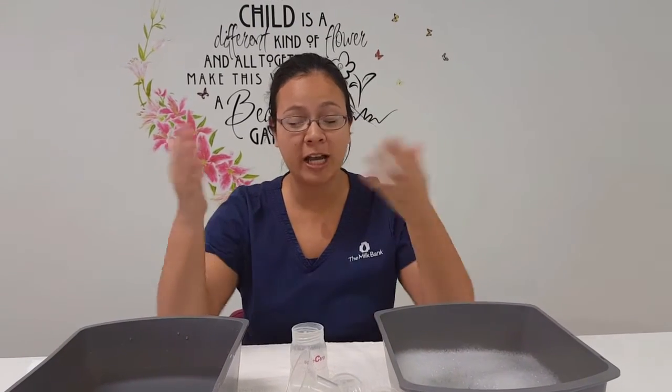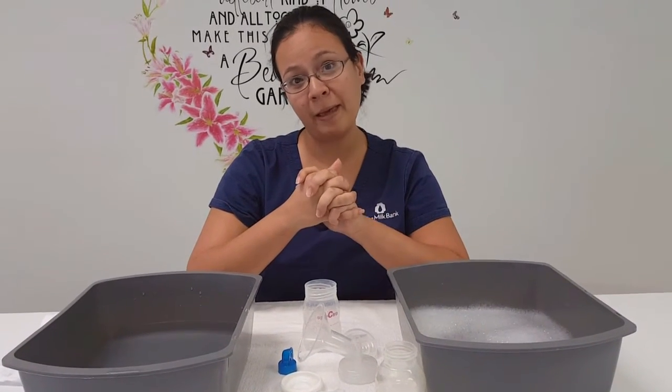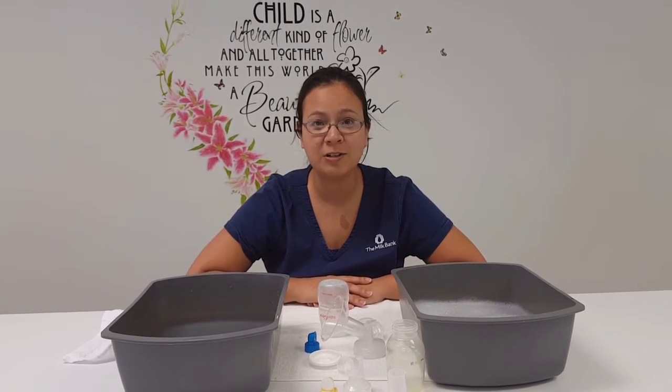And just a few happy reminders: make sure that your hands have been clean and washed before you're washing your pump parts, and also make sure your breasts are clean before you start pumping, since it is summertime and we can get sweaty.